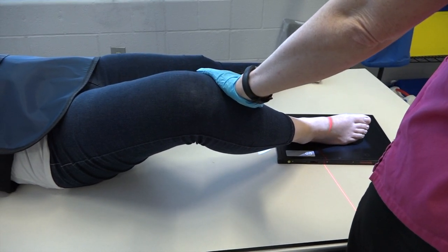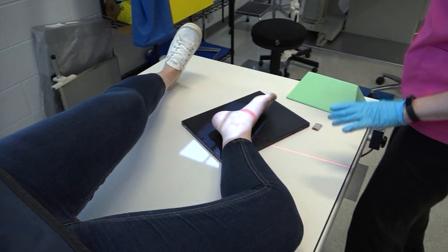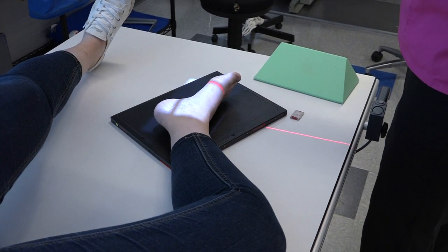You may want to roll over on your right side — that kind of helps. So for the centering, we're going to take off our angle, and the centering is going to be to the medial cuneiform.